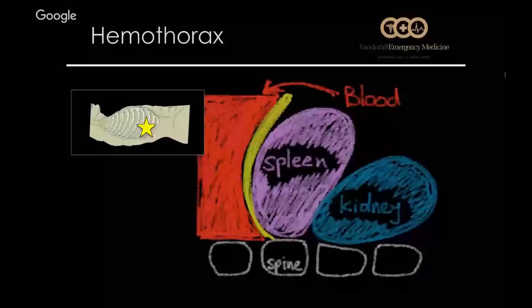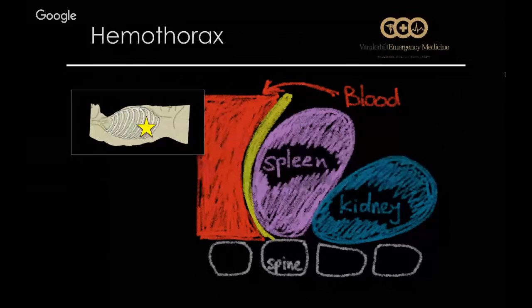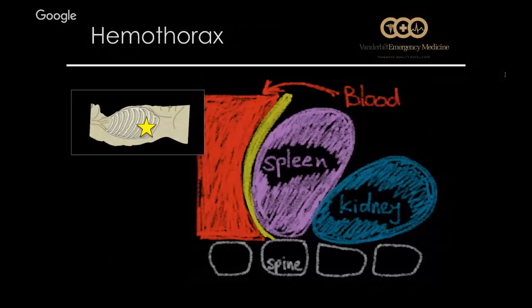So what I'm really cluing in on is at the bottom of the screen, the lumbar spine. When it comes to the edge of the diaphragm, if it stops, that's normal air-filled lung. Whereas if the spine extends past the diaphragm, then there's some sort of fluid in the chest, and in the setting of trauma, that's going to be blood.